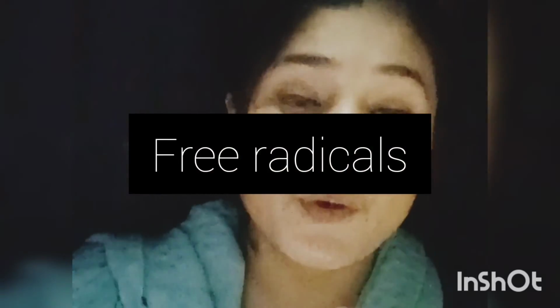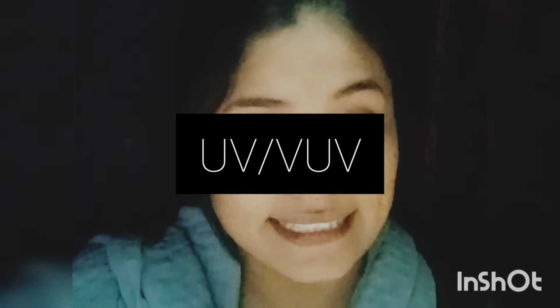Second one, UV, VUV. UV, we all know, is ultraviolet rays. VUV means vacuum ultraviolet rays. And the third step is volatilization. We can go one by one. Before this, we can go through the steps or mechanisms of this gas plasma sterilization.